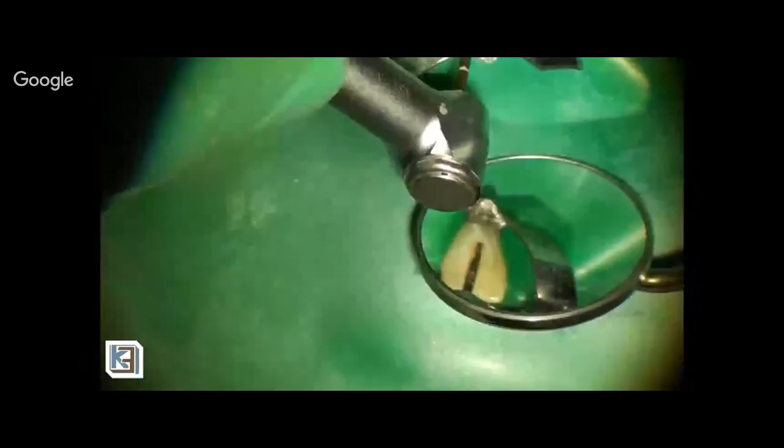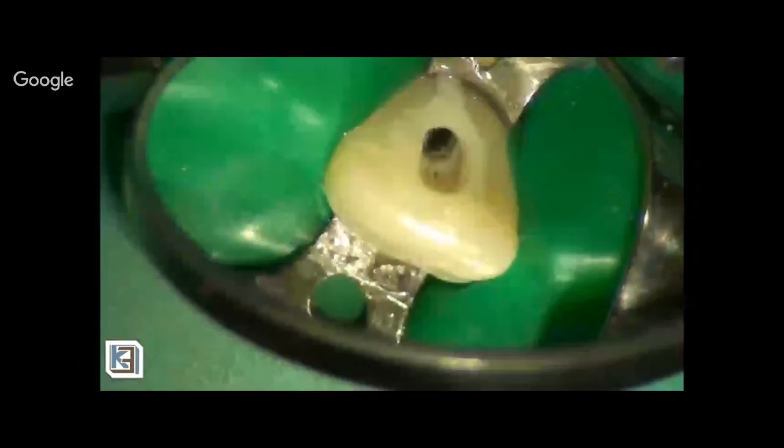This is my Root ZX trying to verify depth, and I'm a little bit short, so we're still negotiating the canal, trying to get to depth. These are ProTaper Gold files, those are my go-to files in my practice. I love them, and they clean very, very well. This is my access hole with my canal prepared.